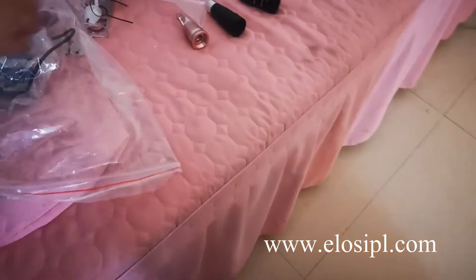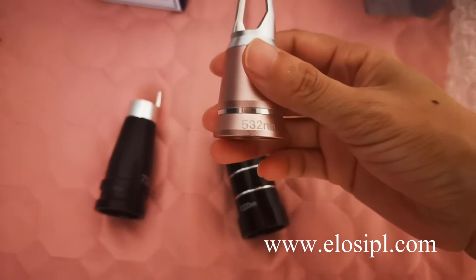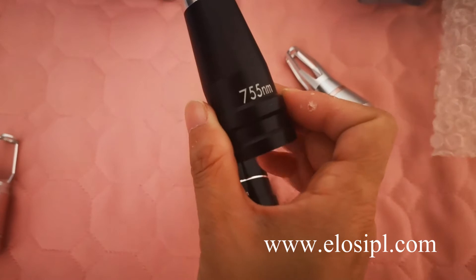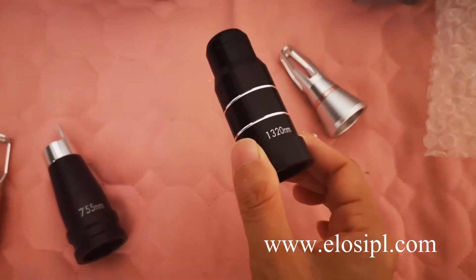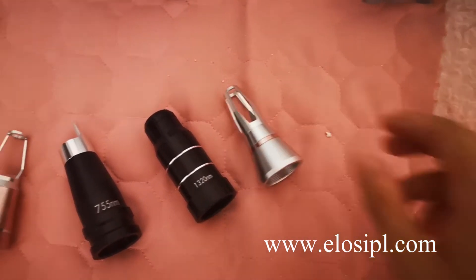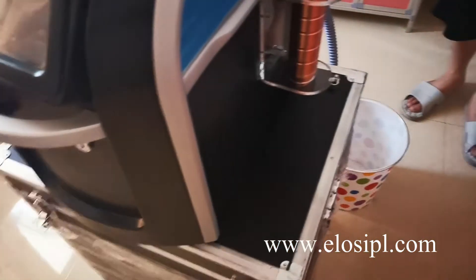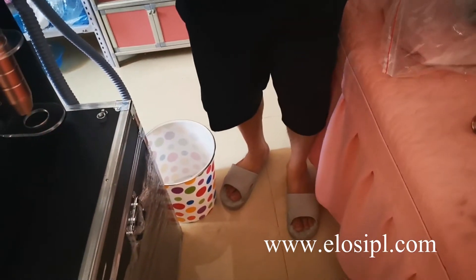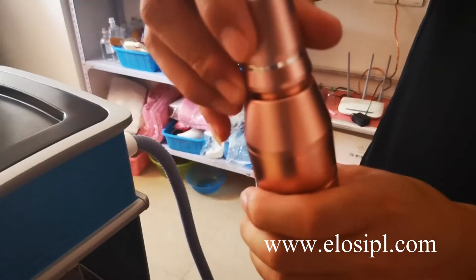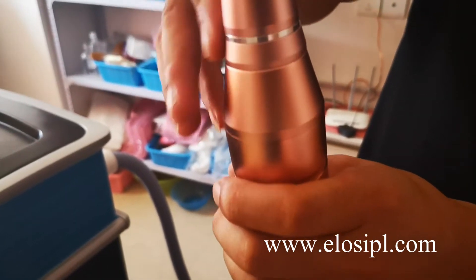The laser handle has 4 treatment heads: the 532 nm treatment head, the 755 nm treatment head, the 1,320 nm head, and the 1,064 nm head. Insert the treatment head into the handle.